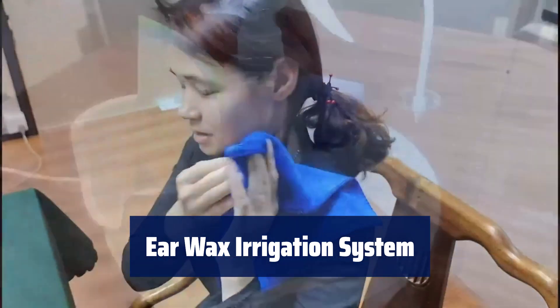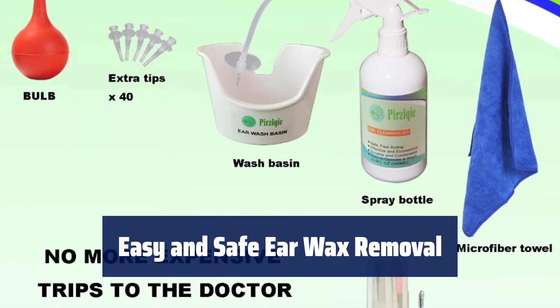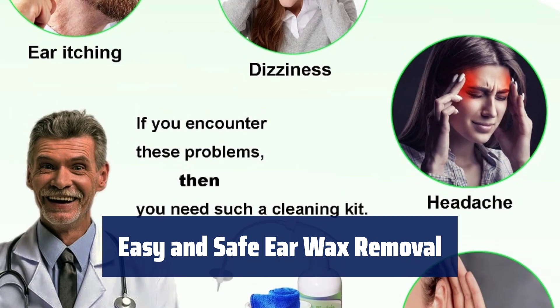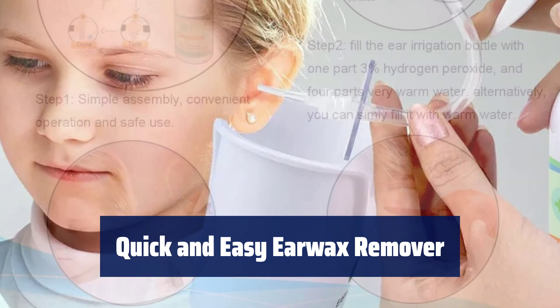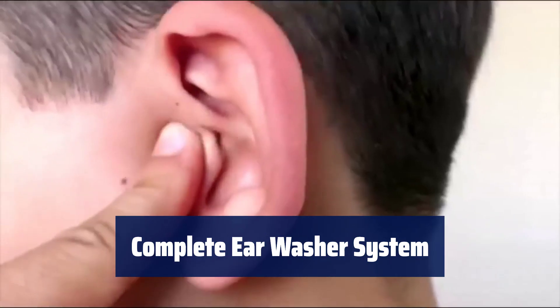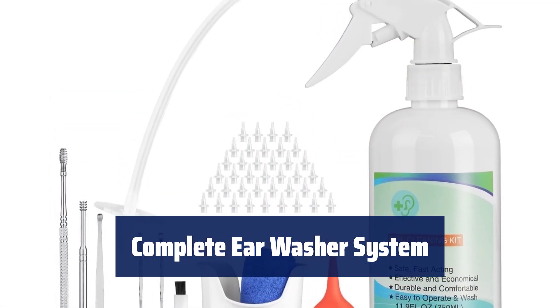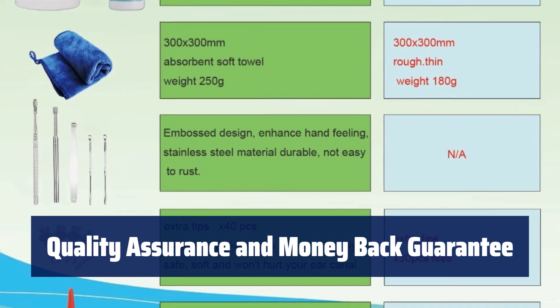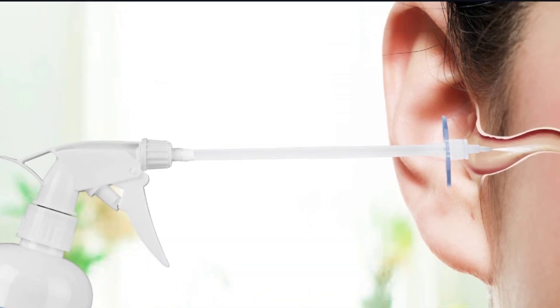Number 1: Save time and money by cleaning your ears at home with this earwax irrigation system — no need for clinic visits. Gently wash your ears to remove wax, dirt, and debris without causing any damage. Quick relief for symptoms like hearing loss and pain. An effective device for all ages to easily remove excess earwax buildup at home, with no pain and peace of mind guaranteed. Comes with everything you need for maximum cleaning effectiveness, including a spray bottle, tips, towel, and more. Buy with confidence knowing that our earwax removal kit is safe for all ages, with a full refund within 30 days if you're not satisfied.